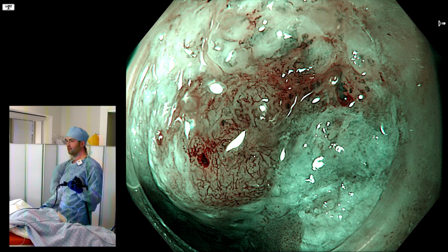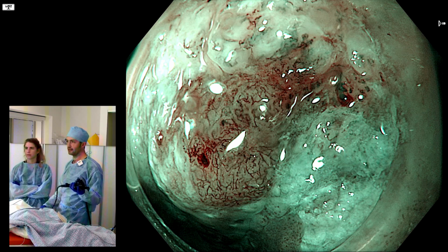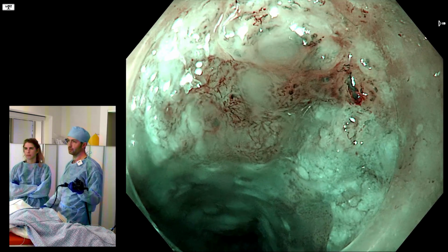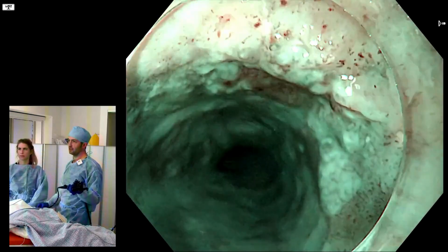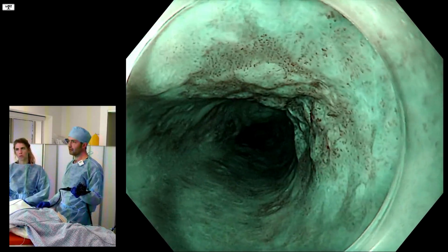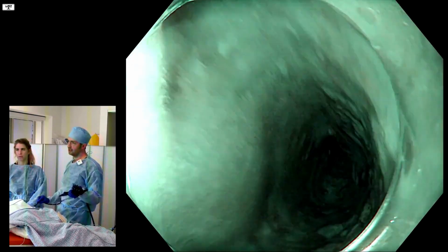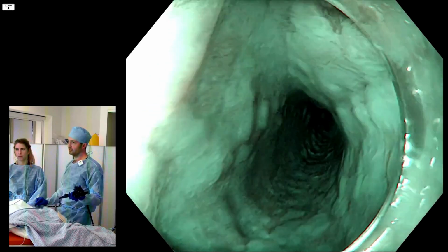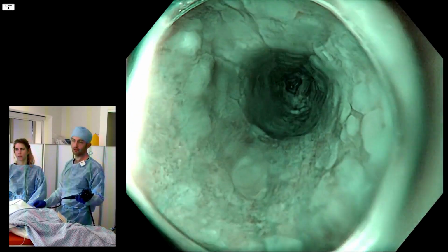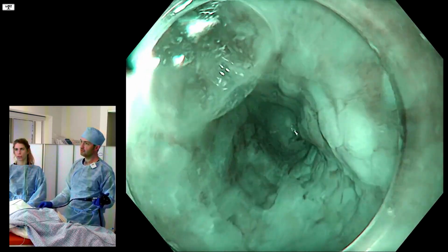And so here, at the very least, you have a disordered pattern of those blood vessels, and they are more dilated, and some of them skip more than one loop. So certainly this is a lesion of concern, and if you are performing a procedure where this is detected, the simple things that you might want to tell your multidisciplinary meeting or your friendly interventional endoscopist plus or minus surgeon is, well, where is it?